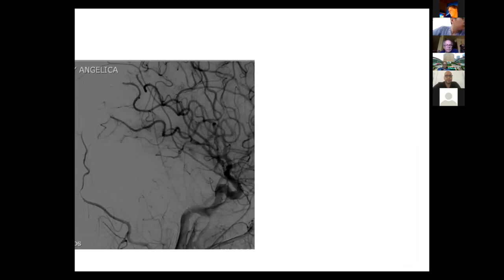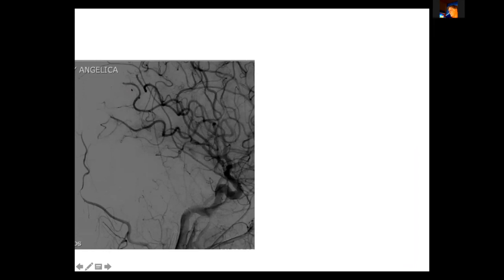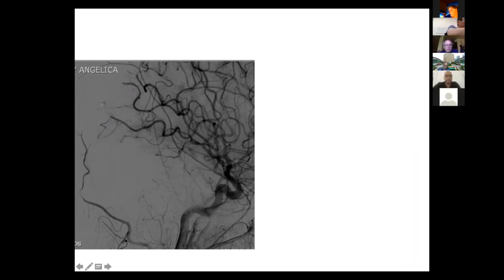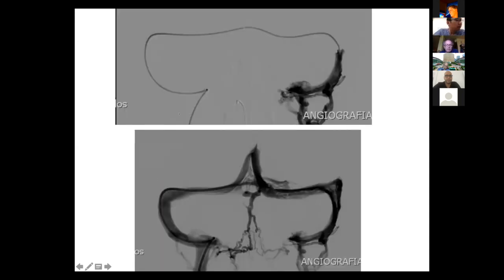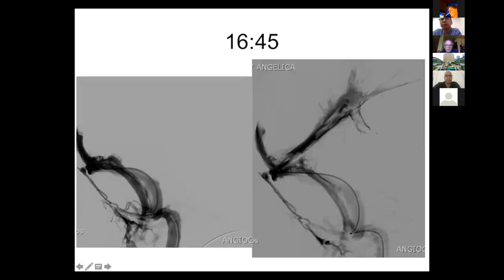The right and left carotid injections show the same morphology. In the arterial study, there are some distal emboli, but these are not the origin of the clinical symptoms. I decided to perform the study of the veins and found changes in the lateral sinus — thrombus — and also in the straight sinus and the internal cerebral vein. The basilar and Rosenthal vein origin were also assessed.